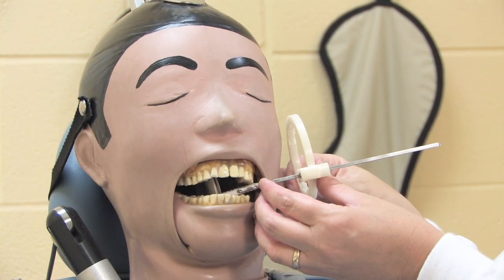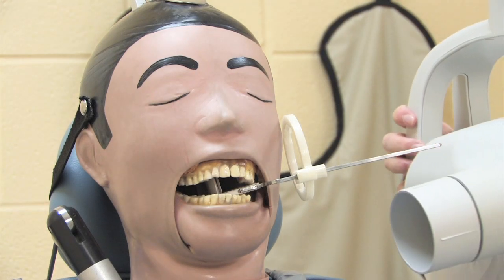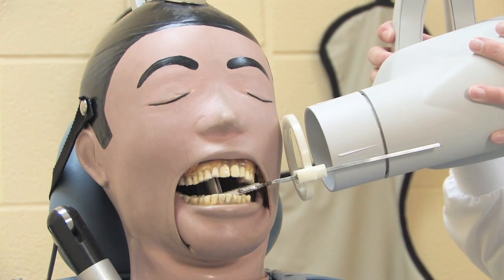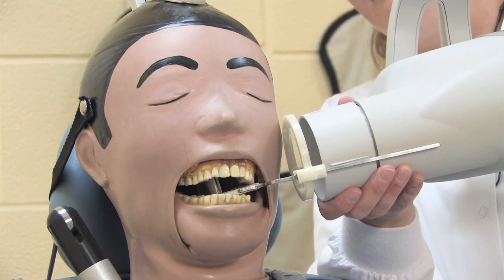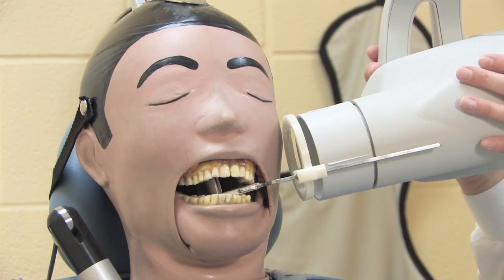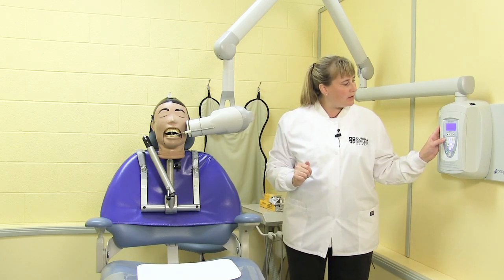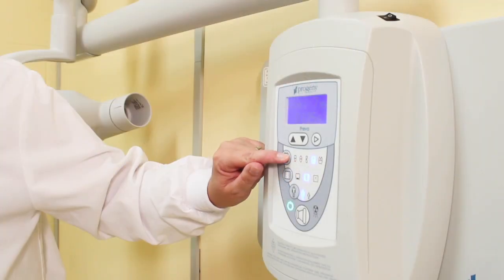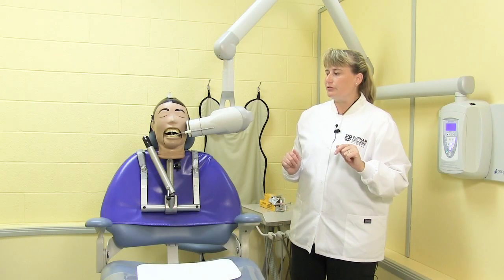The ring is brought close to skin surface but not touching. PID is positioned so that it is flush with the ring for correct horizontal and vertical angulation. I need to select the molar icon for the maxilla, and I would exit the room for exposure.